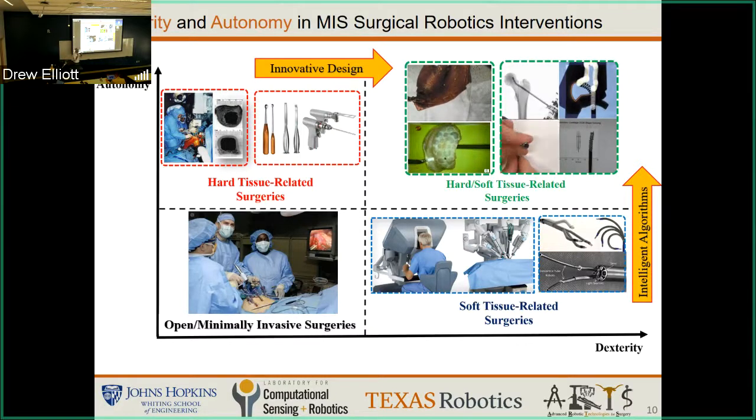But the other thing we do in my lab is develop innovative designs, tools, flexible robots, and even implants that can bring orthopedic surgeries to the right quadrant.